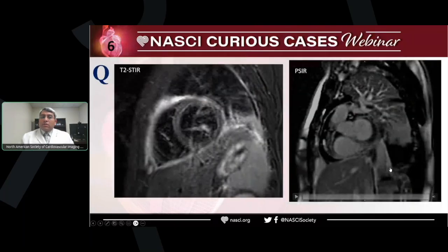Okay. Do you guys have any questions so far as we go through the cases? No, really good cases. Thank you. Yeah, great cases. Okay, so who can take this one?